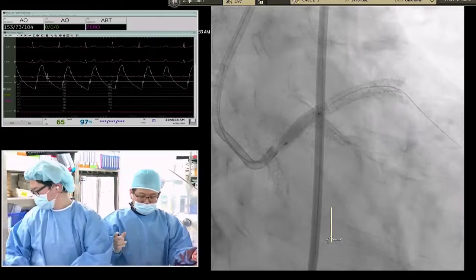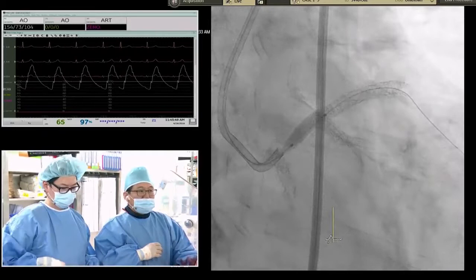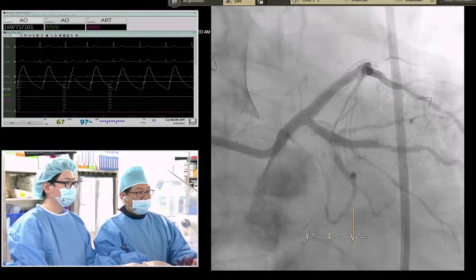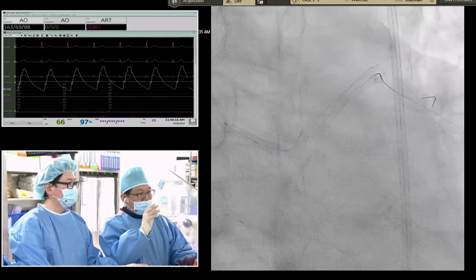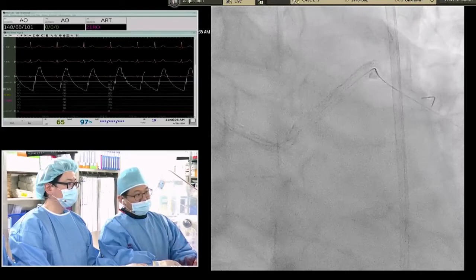Before circumflex rewire, the most important step is LAD stent optimization. Based on the LAD size, I selected the 4.0 high pressure balloon. Sequentially, I applied high pressure, 4.0 up to 28, because the left main is 4.6 vessel size. It is very important not to damage the left main ostium. Pulling the balloon out with the guiding catheter inside is a useful way to avoid damaging the left main stent. Next, the wire to the circumflex.